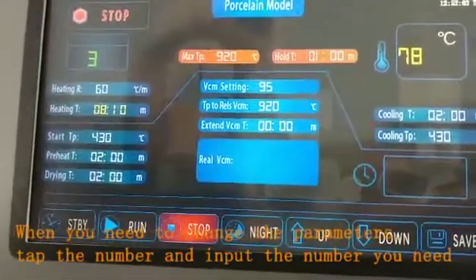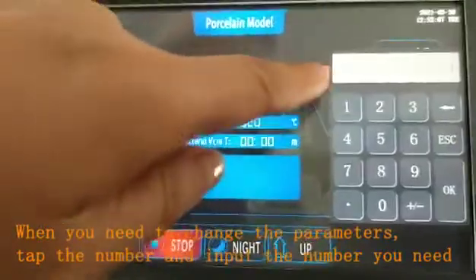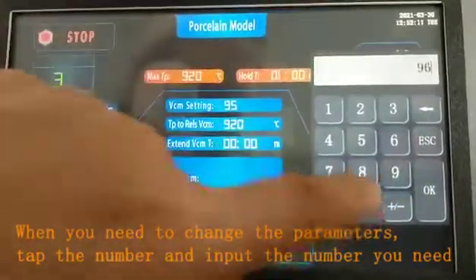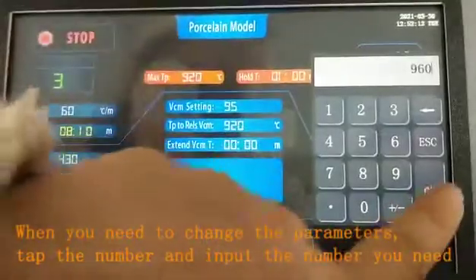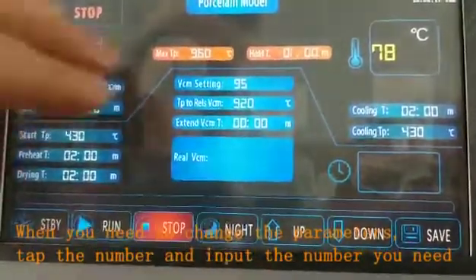If you need to change the maximum temperature, you can press here. You will see a keyboard — for example, enter 960 and press OK. The maximum temperature will then be changed.